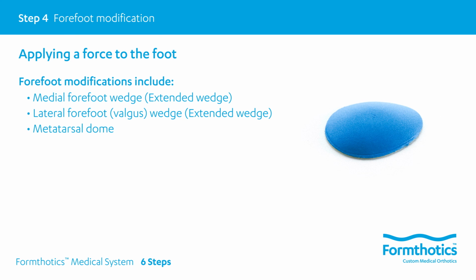Metatarsal domes. Met domes are used to splay metatarsal joint spaces, relieving pressure. Met domes can aid clawed or retracted toes. To apply met domes, apply to the undersurface of Formthotics near the center. An adhesive is applied between the metatarsal dome and the Formthotics. Formthotics have a self-adhesive option, creating on the top a diffuse metatarsal support.